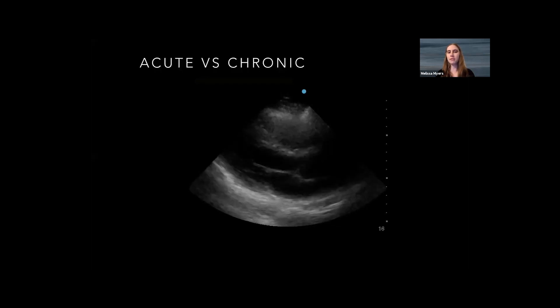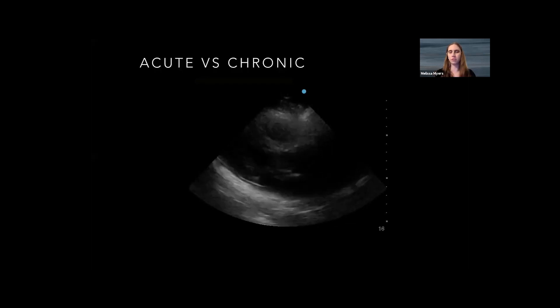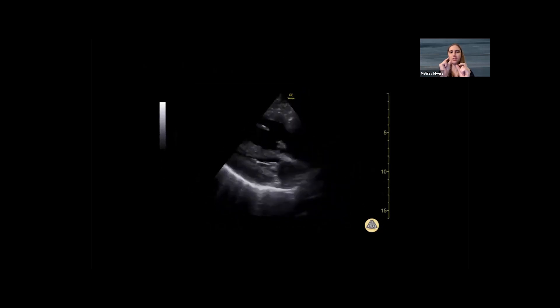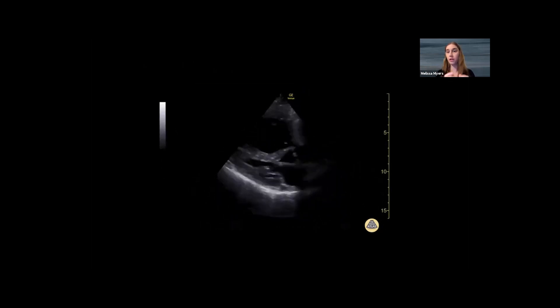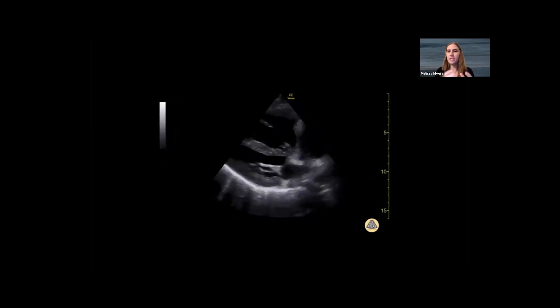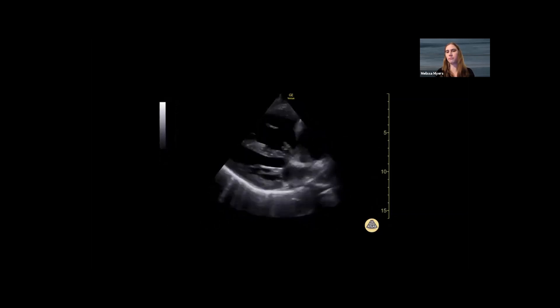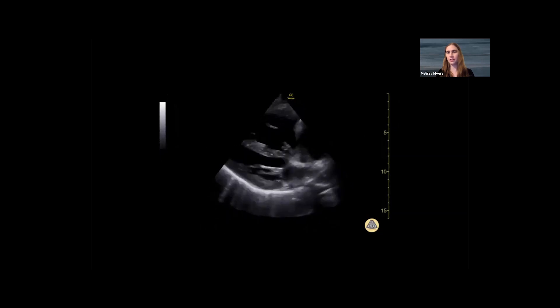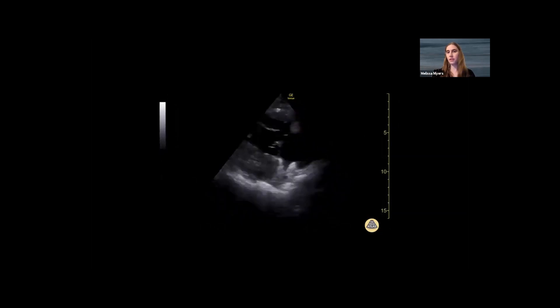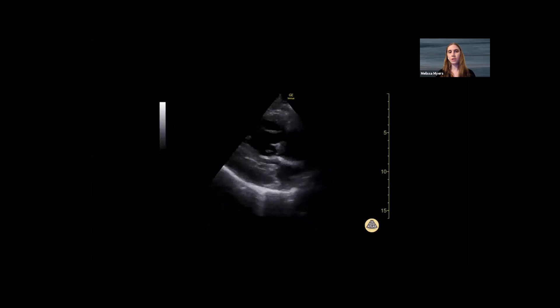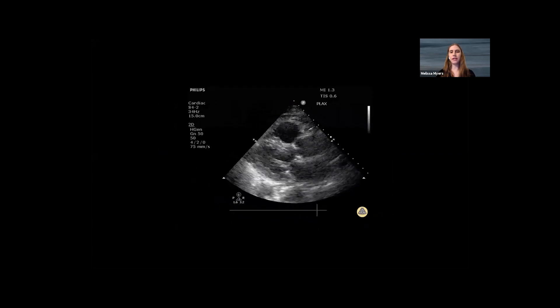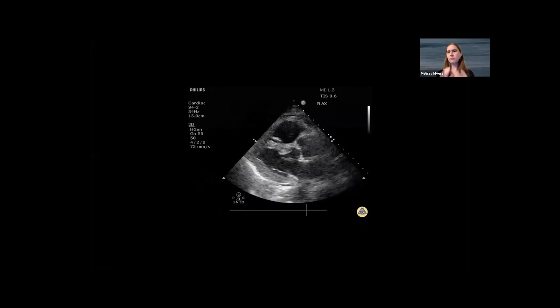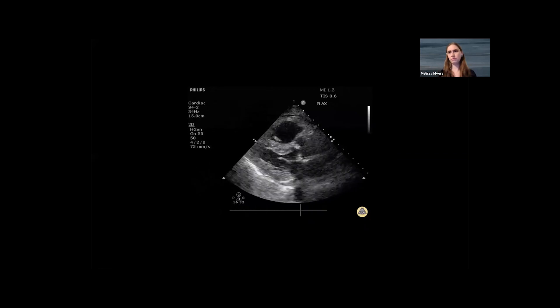Here we have the same normal parasternal long axis view used earlier. Looking at the next example, we can see a thick right ventricular free wall that is clearly greater than 5 mm — that is a chronically remodeled right ventricular wall. You can hit pause and put calipers on the screen at end diastole to measure it and prove to yourself whether it is greater than or less than 5 mm.